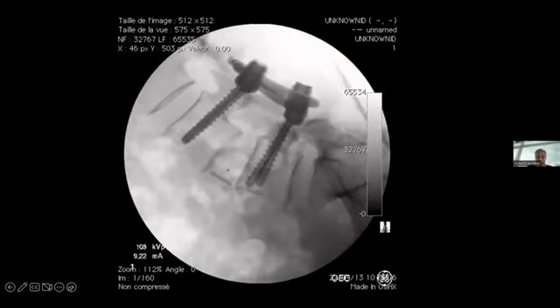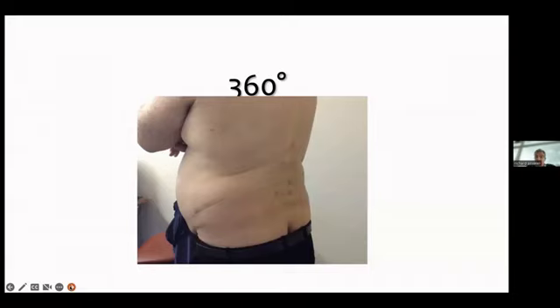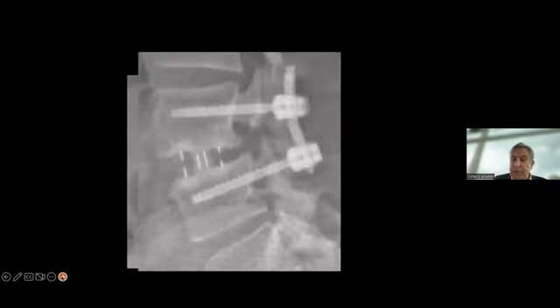When it comes to high pelvic incidence, I do the ALIF first and percutaneous screws second. Here is one such case: ALIF first, then placing the screws second.